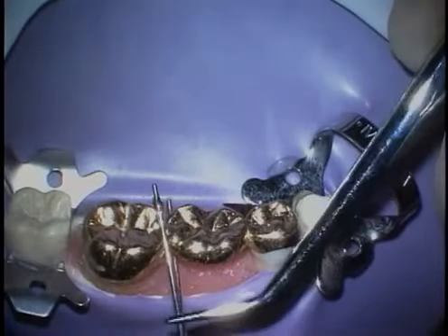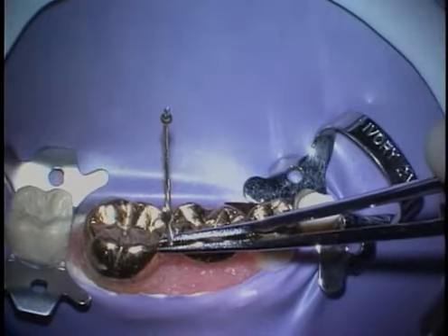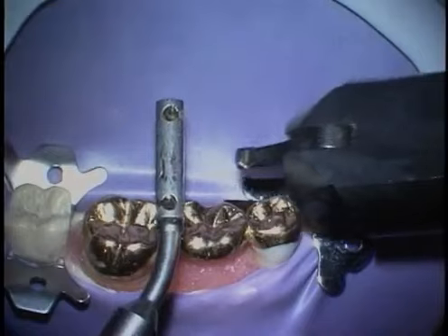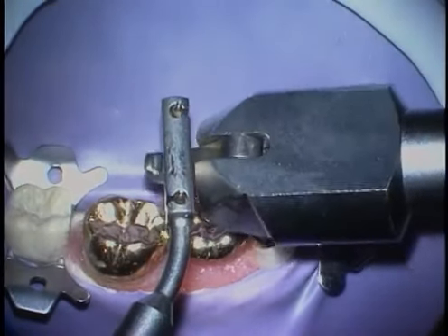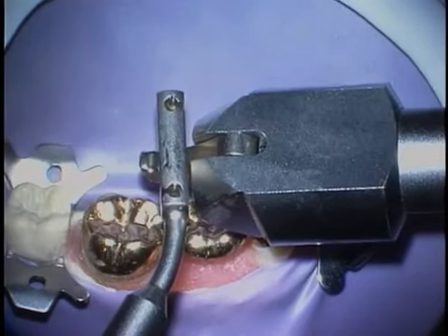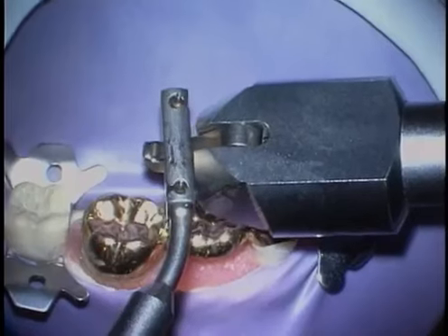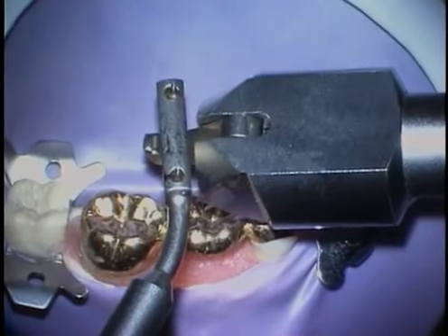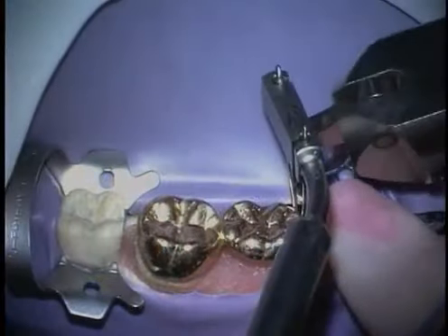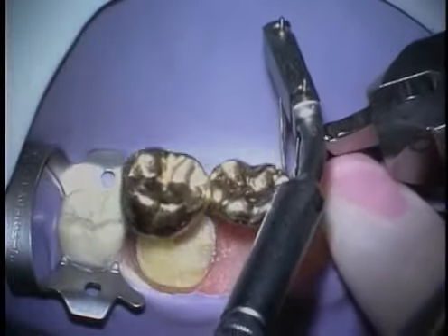A loop is selected and is passed under the solder joint and is positioned as close as possible to the abutment tooth. Each end of the loop is firmly attached to the loop holder. Anticipating the path of removal is critical and allows for correct positioning of the hammer against the loop holder in preparation for trigger activation. Four to five pulses of air are delivered before moving the loop anteriorly and repeating the process. Crowns and bridges retained with zinc phosphate cement are the easiest to remove. With experience, bonded restoratives can also be removed.